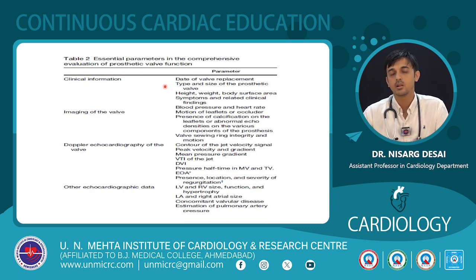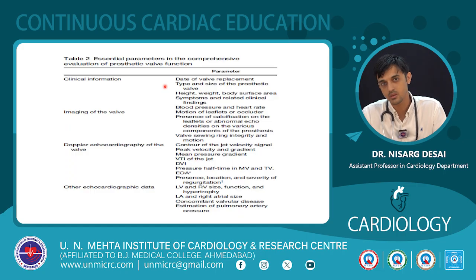For bioprosthetic valves also, degenerative prosthetic dysfunction can be assessed roughly by knowing the date of valve replacement. Then another important parameter is height and weight, with which we calculate the body surface area.